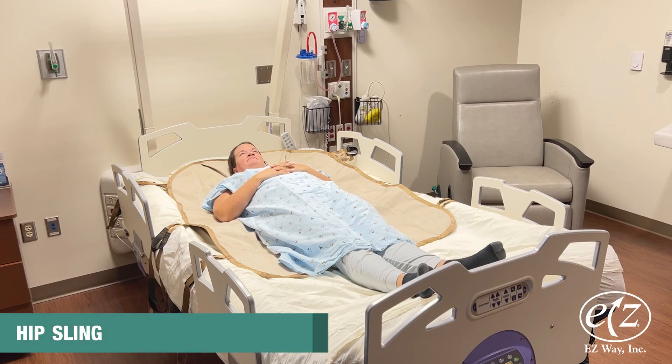The hip sling allows for supine transfers where hip flexure is not recommended. This sling extends from the head to the start of the knees. It keeps the person from bending at the waist, but they can still bend at the knees.